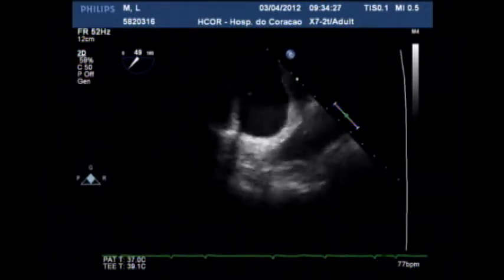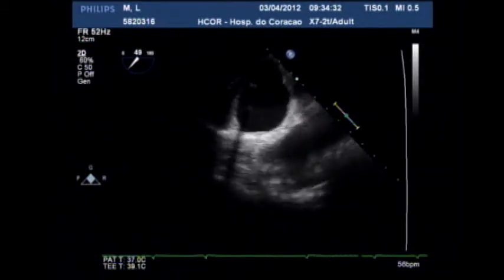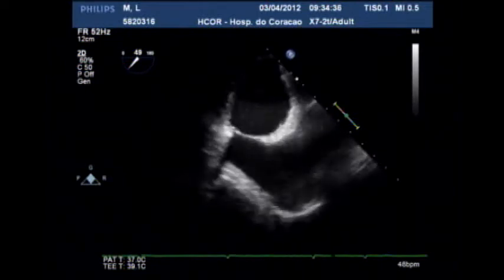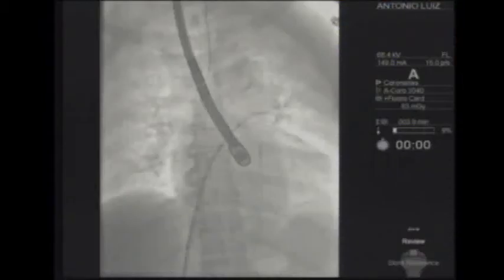Let's inject some dye. Could you see me, please, Rodolfo, a little bit? And we're going to see some dye in the left atrium, and we can see the bubbles in the left atrium. Okay, so this is the way to do the transeptal.